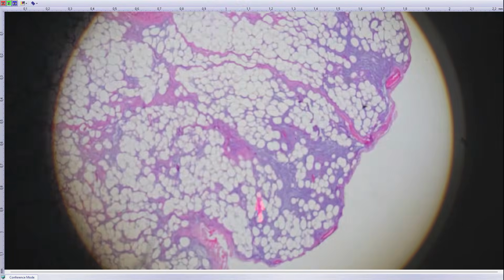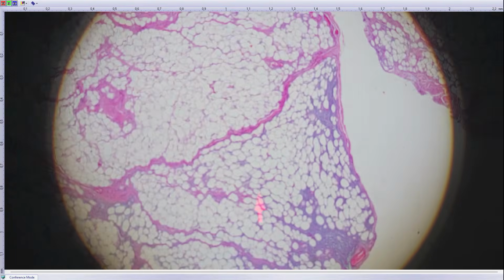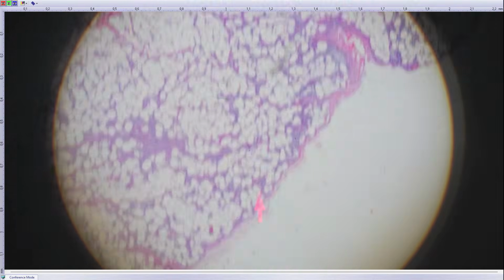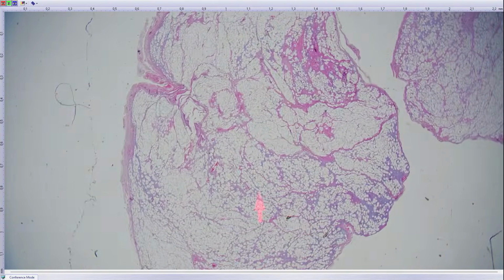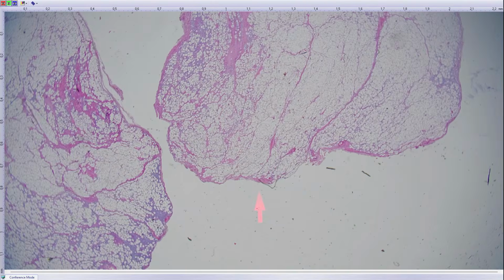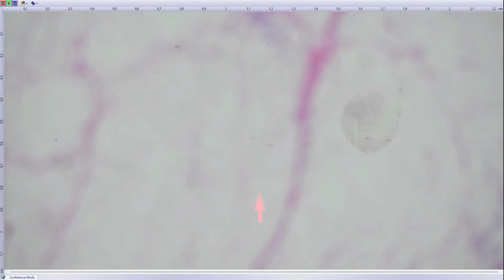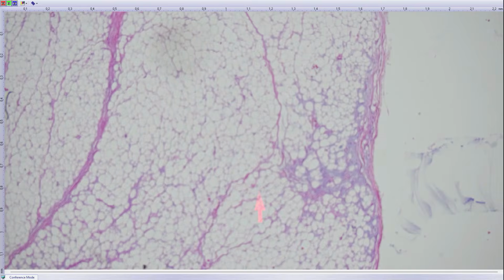And at about the same week, another case, which is somewhat in the differential of these tumors. It was a knee area of a 75-year-old lady. So this is a superficially located tumor somewhere in the subcutis, which is important in lipomatous tumors. Whenever tumors are superficial, they are very likely benign. Even without looking at the histology, there is a high chance that the tumor will be benign. So this is a superficial tumor.